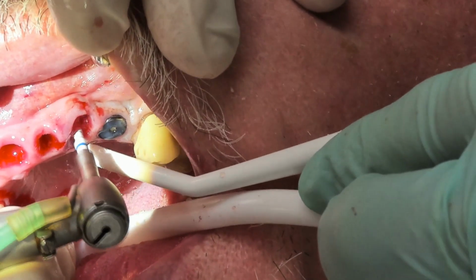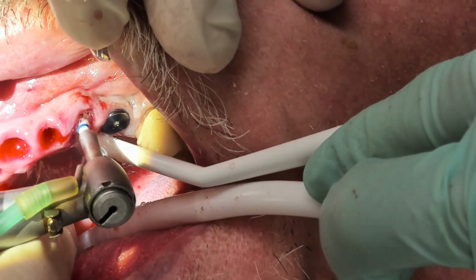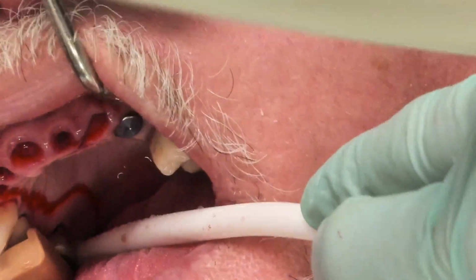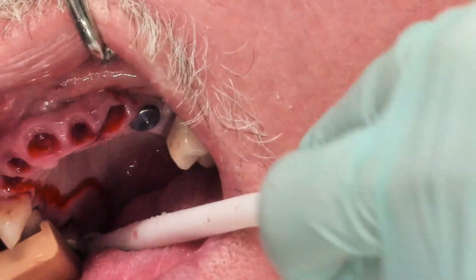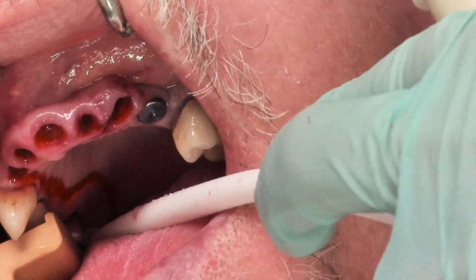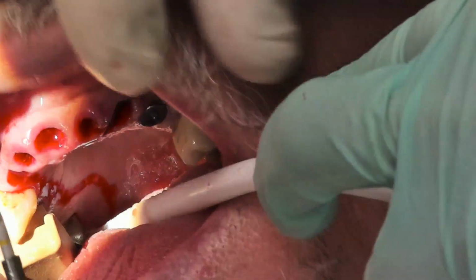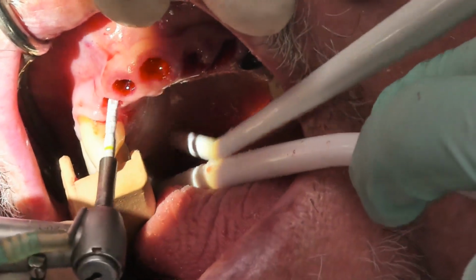Now with the taper, do you do any type of different drilling sequence or protocol compared to the straight one-piece or two-piece implants? Yes, I change my osteotomy site preparation by going with a softer bone technique. I'm going to undersize my osteotomy so that I can have good mechanical cutting of the aggressive thread pattern of the one-piece implants.